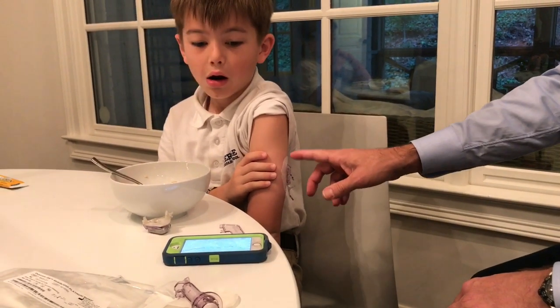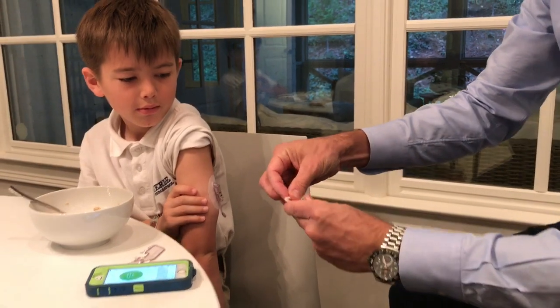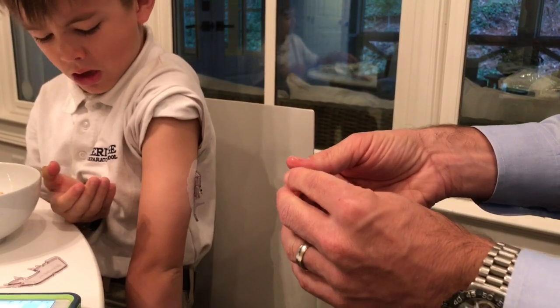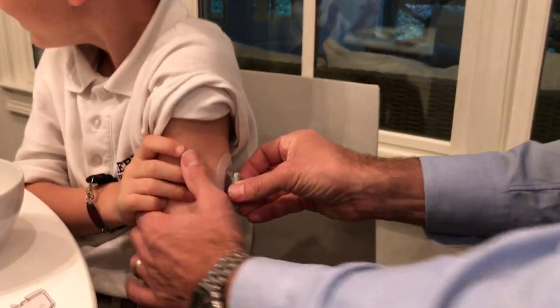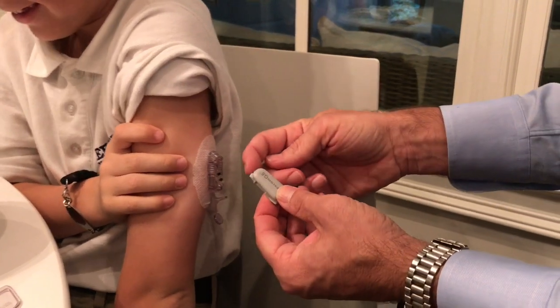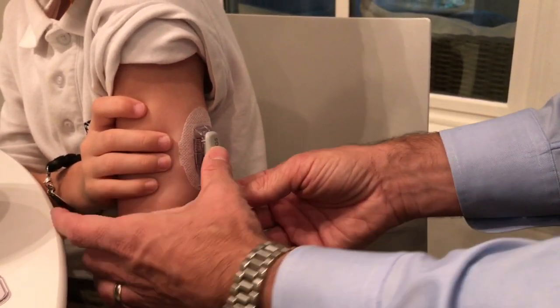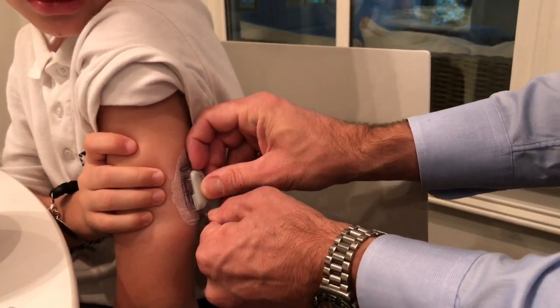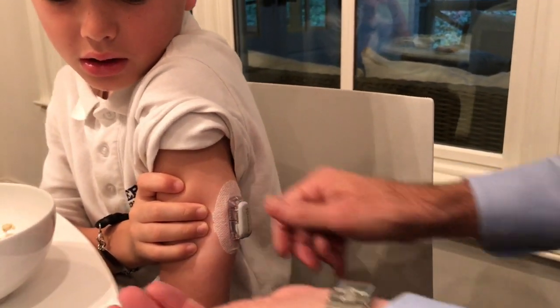We have our transmitter that we're going to put into the sensor. We wipe it off with alcohol and make sure it's clean. Now we'll simply put it in here — the little forked end goes up underneath there, then this piece here helps us push it in. You hear it click — it's in. Then this piece just twists to take it off.